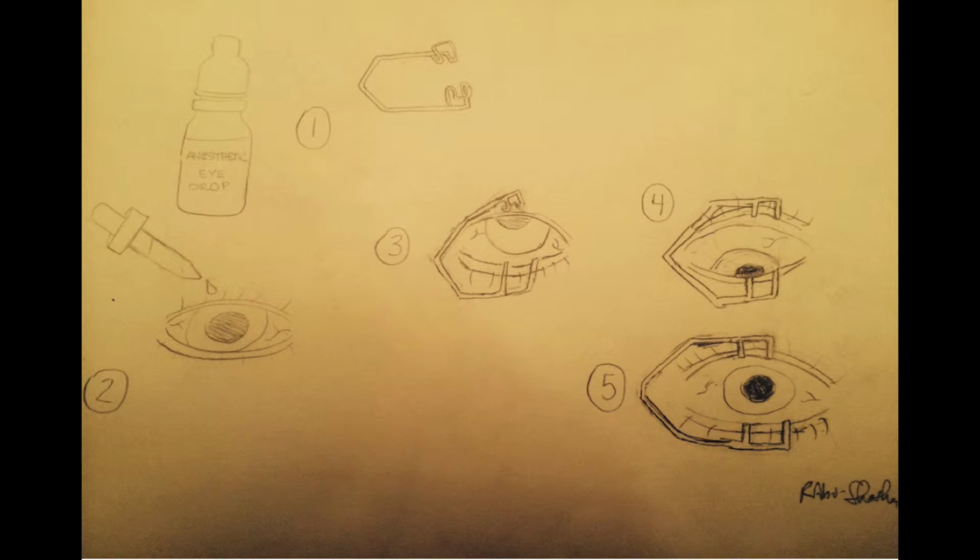Before I begin on the steps, I would like to mention that in terms of positioning, I would like the patient usually to tilt their head back, as this gives me a better view of the eye.